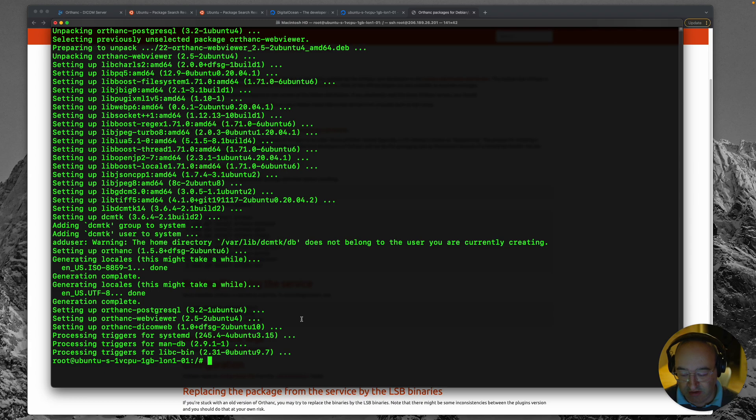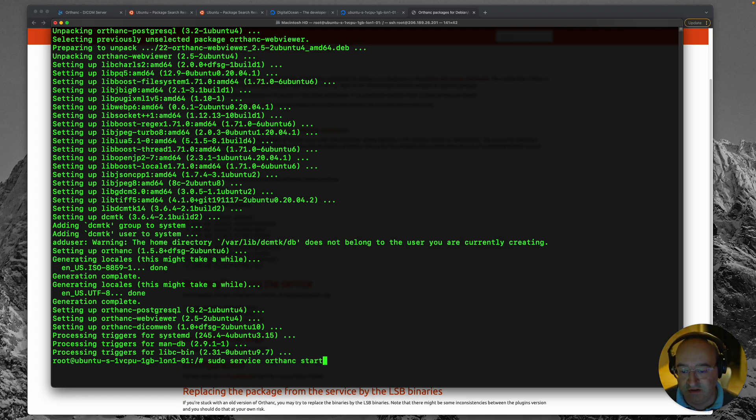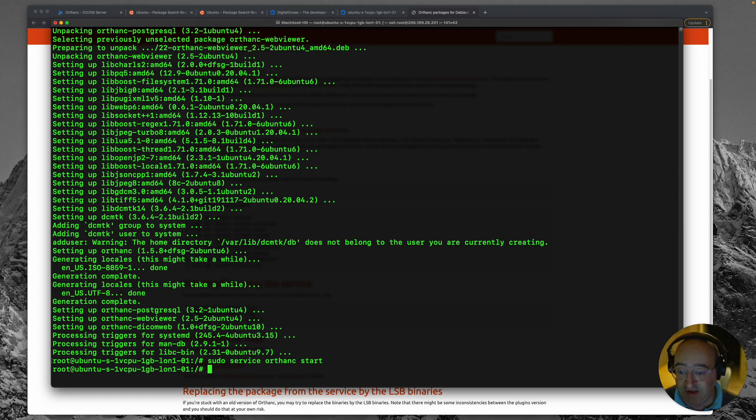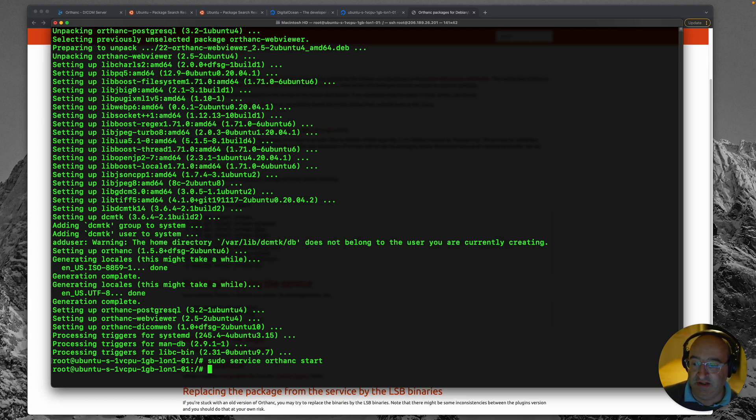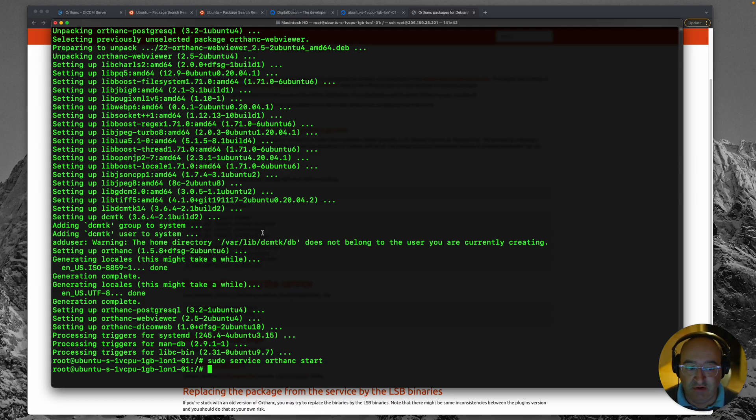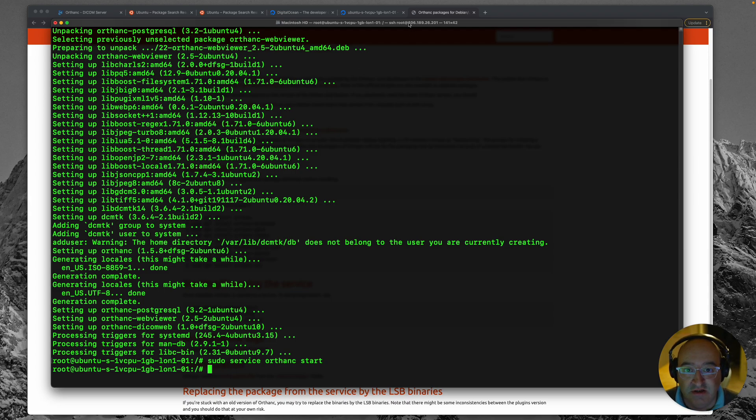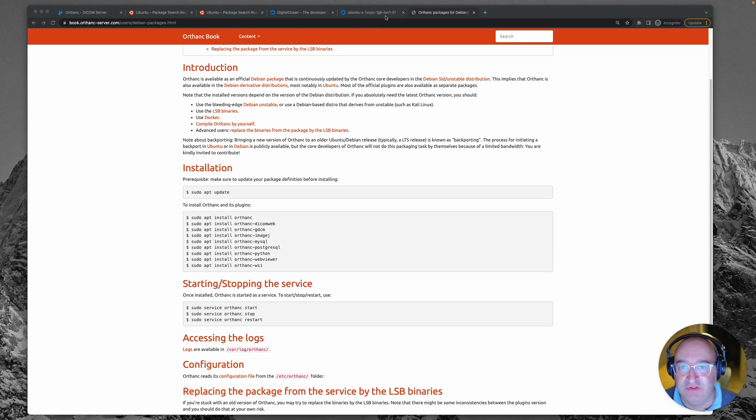So sudo service orthanc start. I think I got that the wrong way around. Orthanc start. Not a very gratifying thing, but apparently that started the Orthanc service. Now what I know about Orthanc is that it runs on a predictable port which is port 8042. 8042 and I'll show you what that means in a web browser.